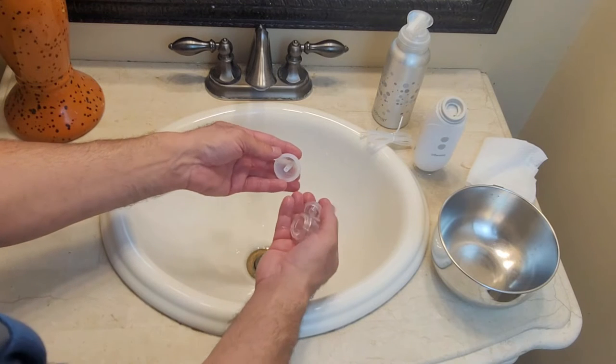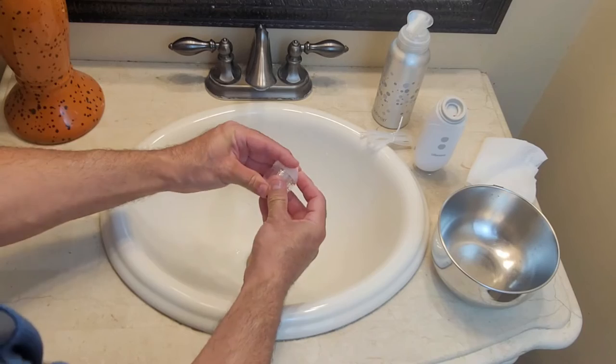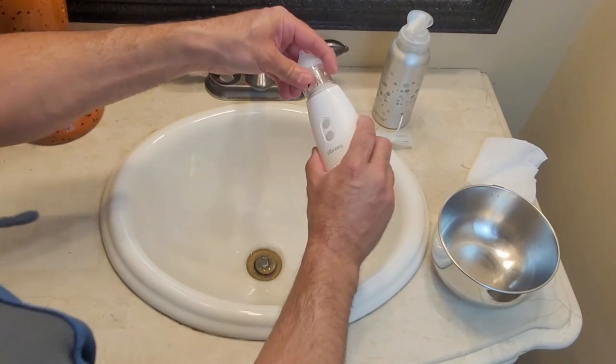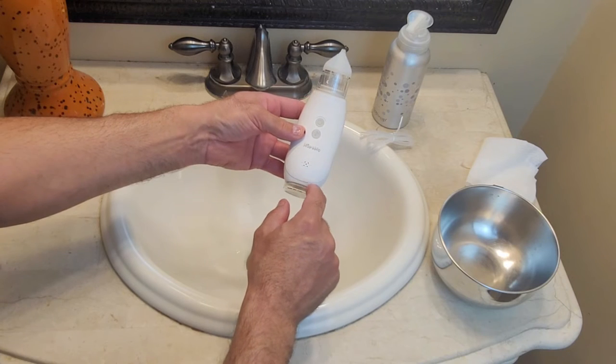When you're all done there, go ahead and reassemble your device. Remember that this device cannot be submerged or rinsed in water.